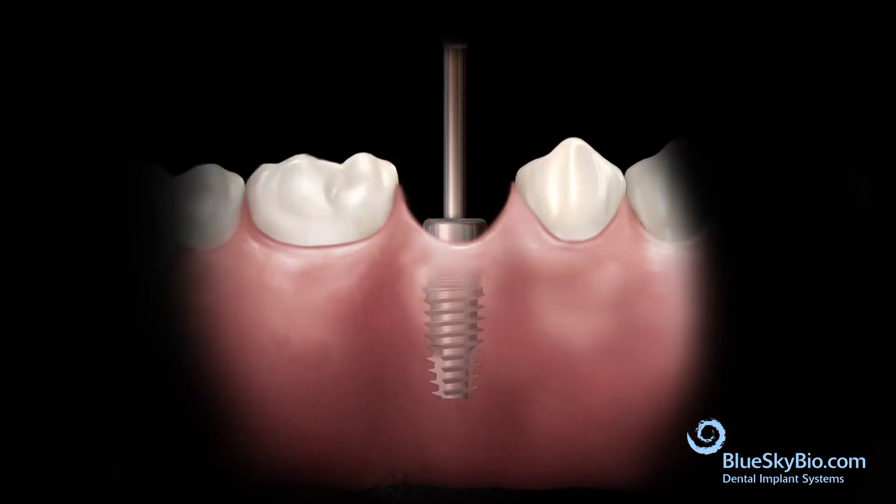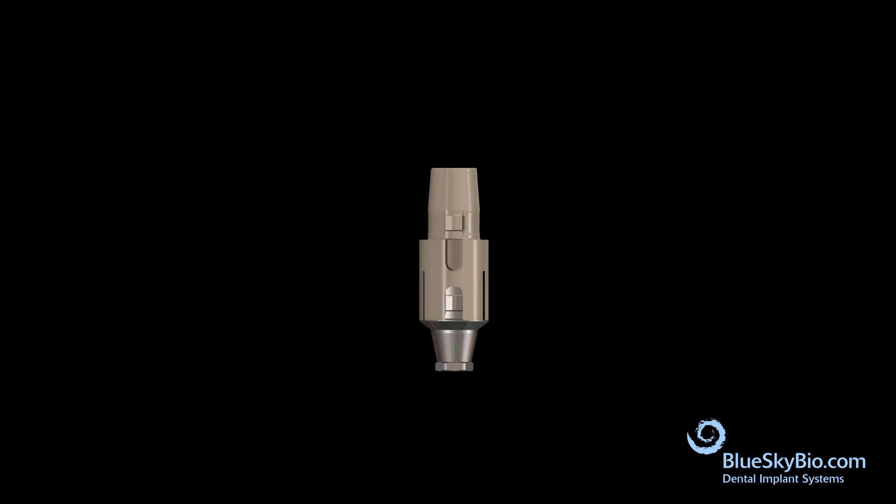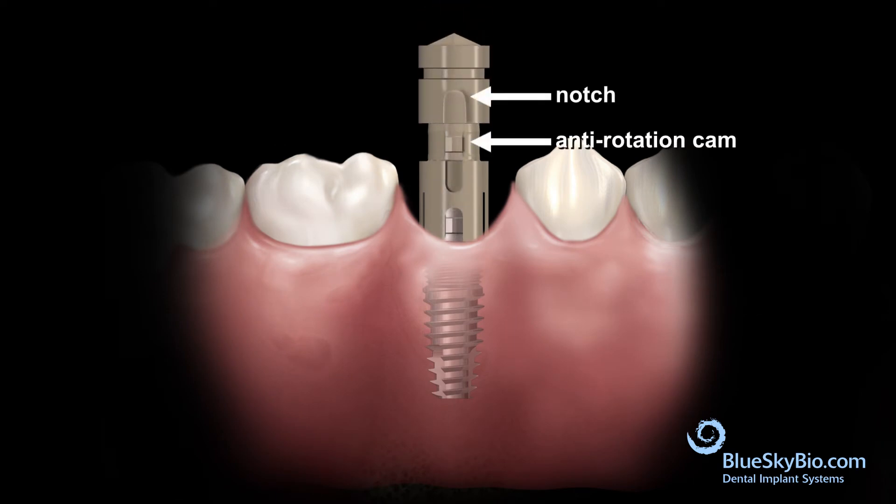Remove the healing abutment. Orient the notch of the Rosetta scan body adapter with the anti-rotation cam of the titanium base abutment and press together with firm finger pressure. Insert the assembled Rosetta components with the titanium base abutment into the implant and tighten the screw with light finger pressure.